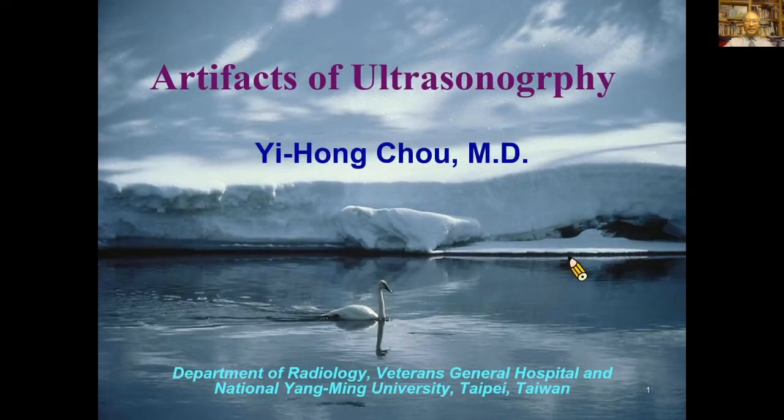Good morning, teacher and dear friends. It's my honor to join you for the workshop. My topic this morning is about artifacts of ultrasonography. As you can see here in the picture, there are some artifacts. For example, here, an image on the surface of the lake is not real, so it is an artifact.